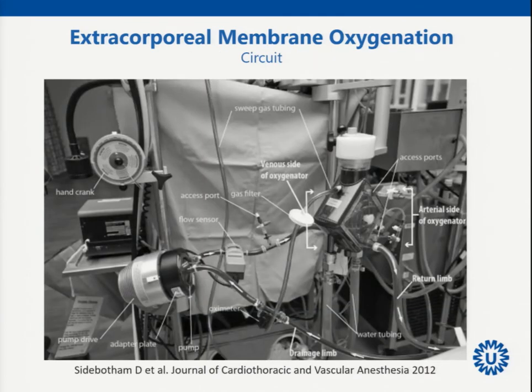So this is the setup, again, at the bedside. So a lot of components. And you will see that every hospital actually chooses its own circuit. And you can choose different side ports, but every side port that you have is a risk in terms of air embolism, but also in terms of infection. It can break off simply. So what we tend to do is keep the circuit as simple and straightforward as possible. So we do not opt for any side ports within the circuit.